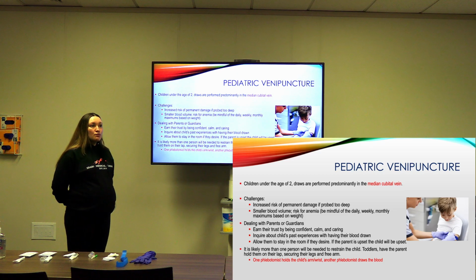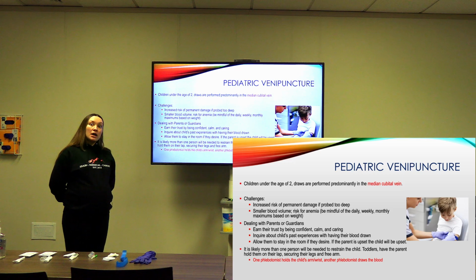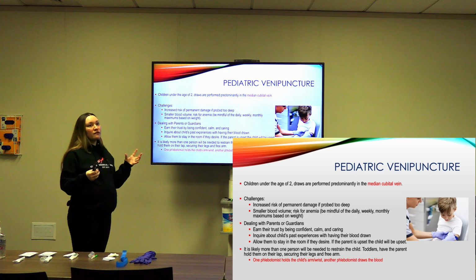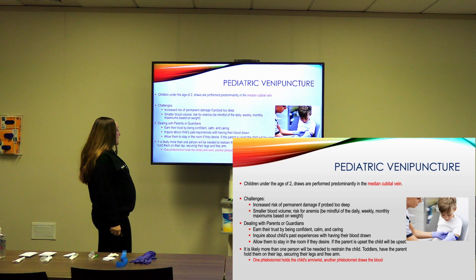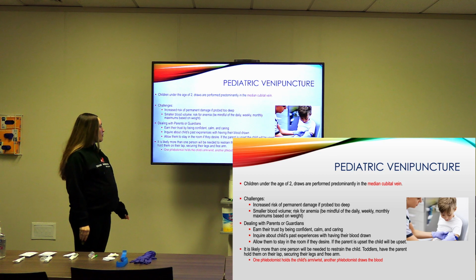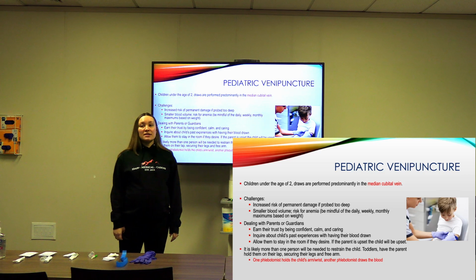Absolutely allow them to stay in the room. Most patients will. If the parent is upset, generally the child will be upset, okay? It's a direct energy. The children feed off the parent's energy. It is likely more than one person will be needed to restrain the child. Toddlers have the parent hold them on their lap, securing their legs and free arm. You can do this in the outpatient or inpatient setting.